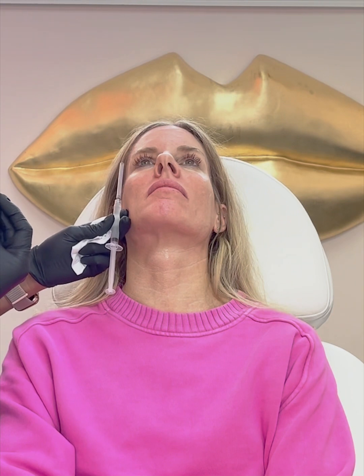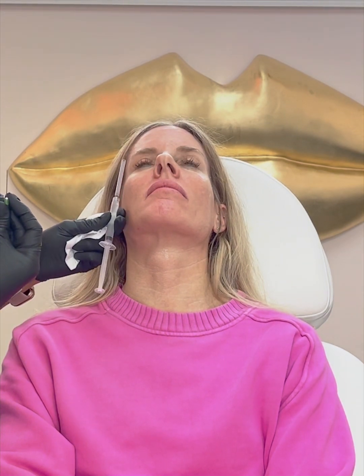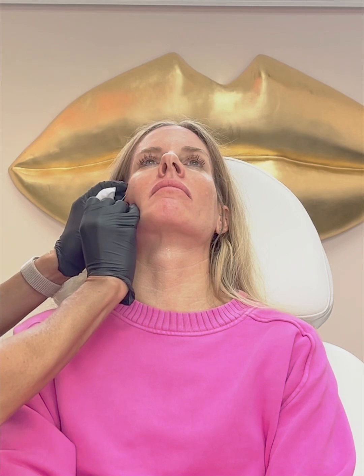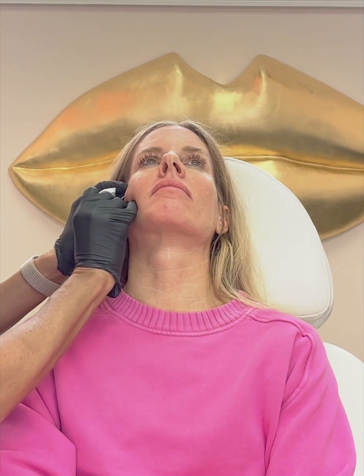Here we are treating with Sculptra, and for this patient I am utilizing a cannula. So this is not a needle. A cannula is very similar to a straw in that it's blunt on the end. It is not sharp like a needle. So in order to get the cannula up under the skin, we have to create an opening. So that's what I'm doing here.